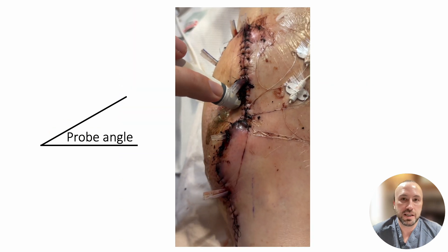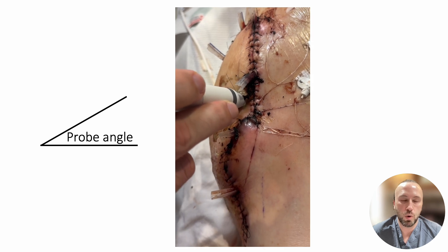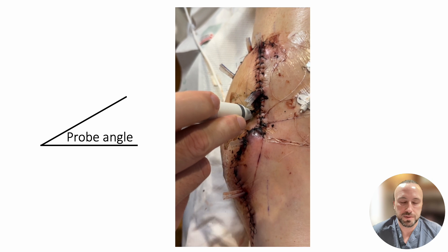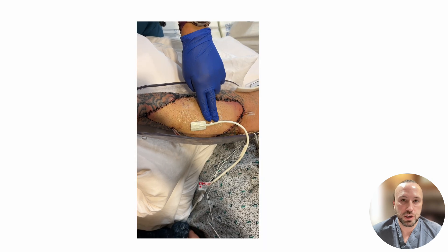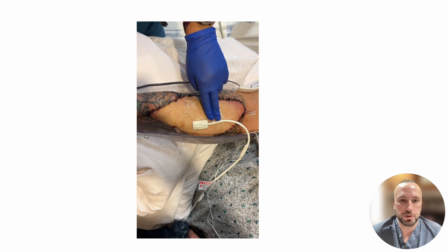If you cannot initially find a signal with the Doppler, you may need to adjust the angle of your probe or search in the area around the blue suture. External pressure or positioning causing pressure to the flap may obstruct blood flow, making it difficult to find a Doppler signal.